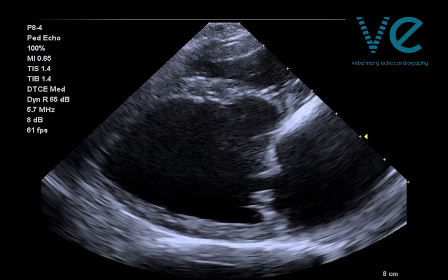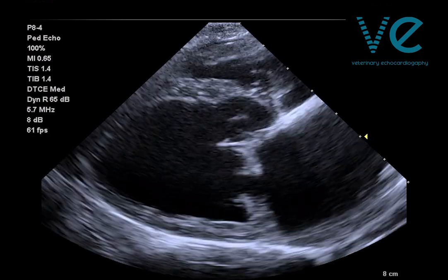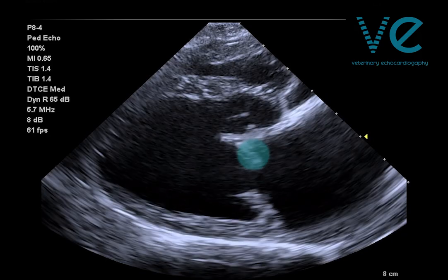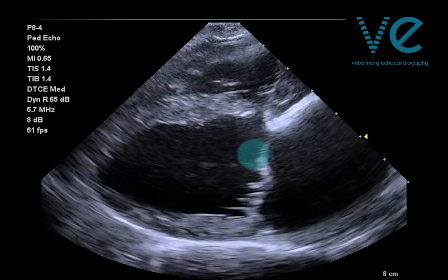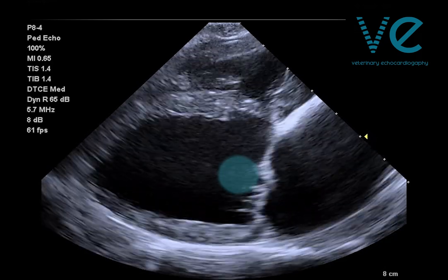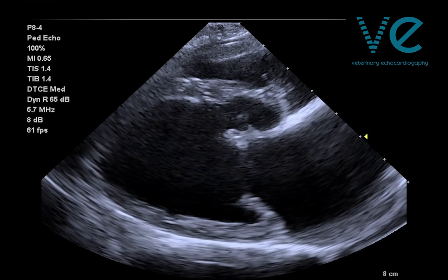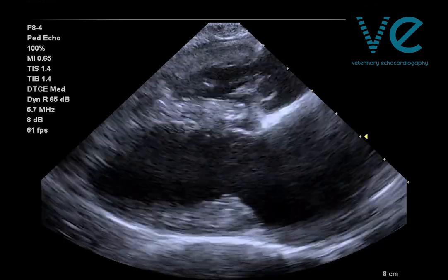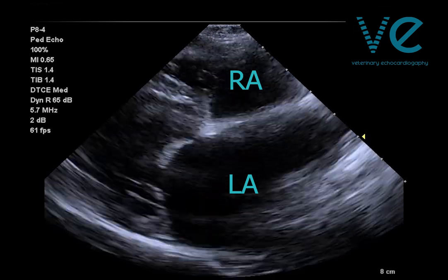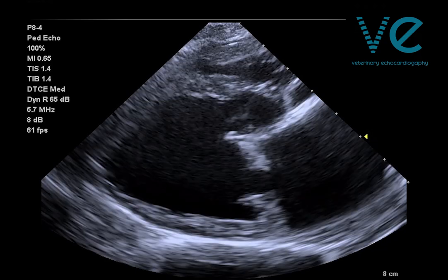Let's take a look at this patient. What can we see? There are thickened mitral valve leaflets — the anterior or septal leaflet is particularly thickened and there seems to be a slight loss of coaptation at the tips. The left atrium is severely dilated; you can see that just by comparing it with the right atrium across the septum. And the left ventricle looks very dilated as well.